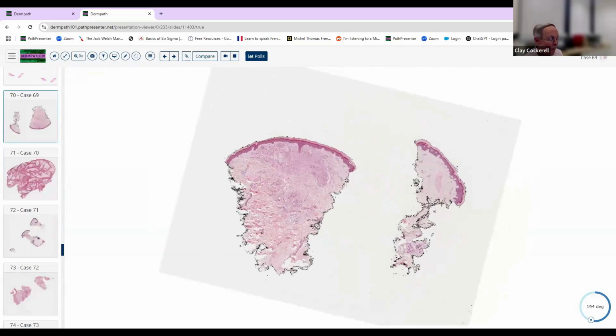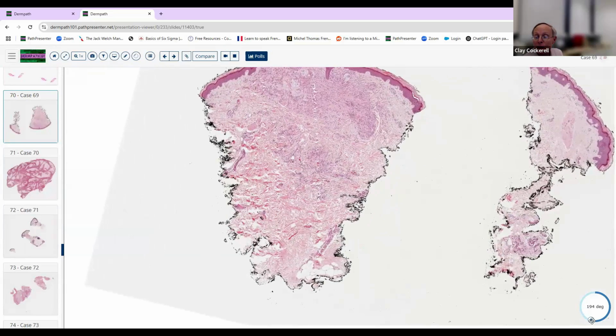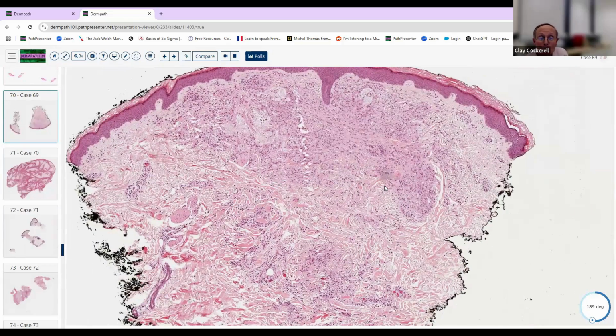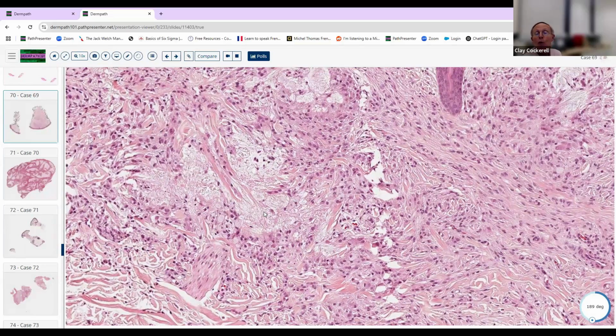Number 69 here. We have this in here to compare with the xanthelasma. This is an example of eruptive xanthoma. Notice that these cells almost look a little like GA. These cells have flown into the dermis quickly. They also can fly out of the dermis quickly. If you take these people's lipid levels and reduce them to normal, believe it or not, these lesions can almost vanish before your eyes. They can disappear very quickly.